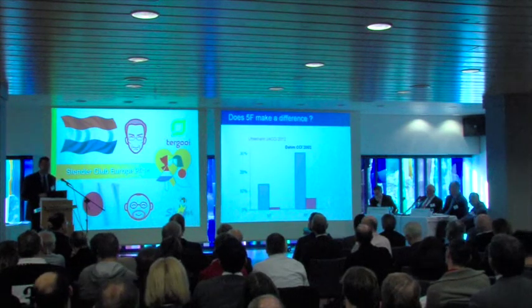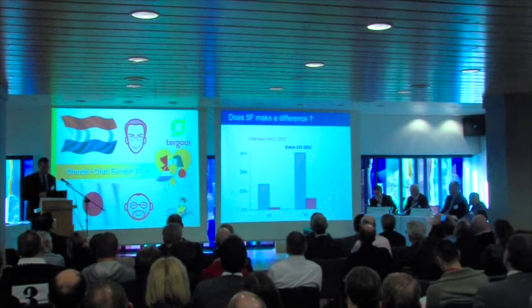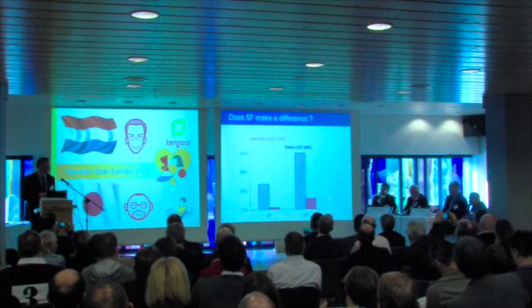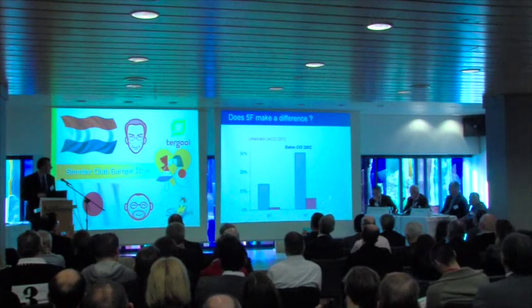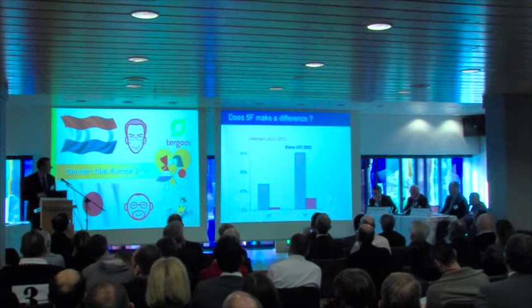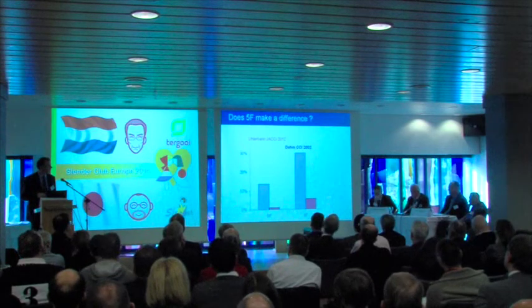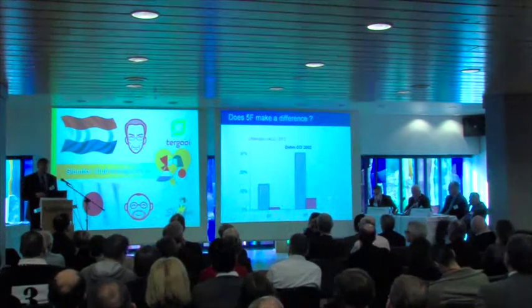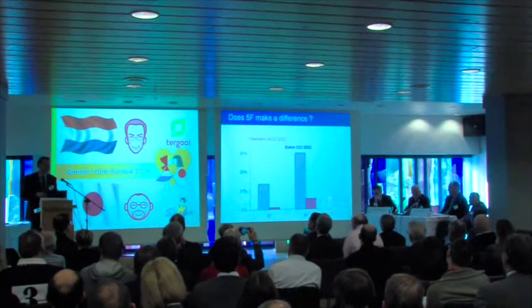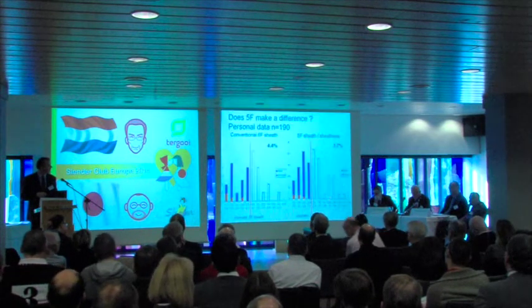Does 5 French make a difference? Well, I'm sure 5 French does make a difference. These are the 2 published studies that show reduced radial occlusion rate with 5 French. But one of the issues here is that the occlusion rate in this study from Leipzig was actually higher in 5 French than it was in 6 French in the other study. So I don't think that we've yet got very good data showing that downsizing reduces radial occlusion, but we'll come on to that and deal with that much more extensively later on.